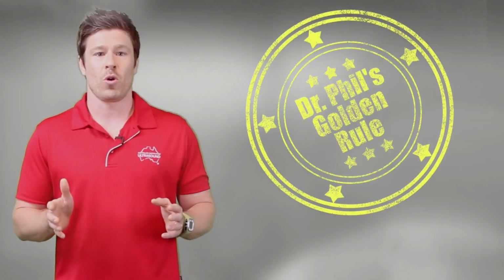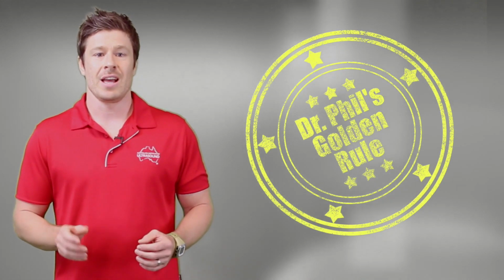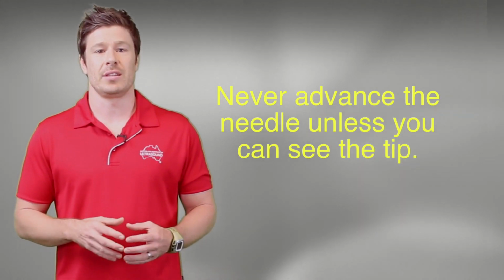Finally, always remember the golden rule of ultrasound guided regional anaesthesia and never advance the needle unless you can see the tip.